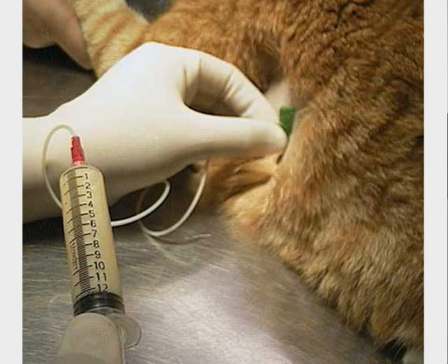The other thing that's important in classification is, is it very cellular? Well, we can assume that most fluid that isn't clear is going to have a lot of cells in it. This is a chylothorax, and this may be one of the exceptions to that, but let's not go with that. Let's talk about total protein and cellularity, often referred to as the total nucleated cell count, which you are going to do a little bit more of in lab. There is a table in your lab class, and there's also one in the Sirois text on page 387.